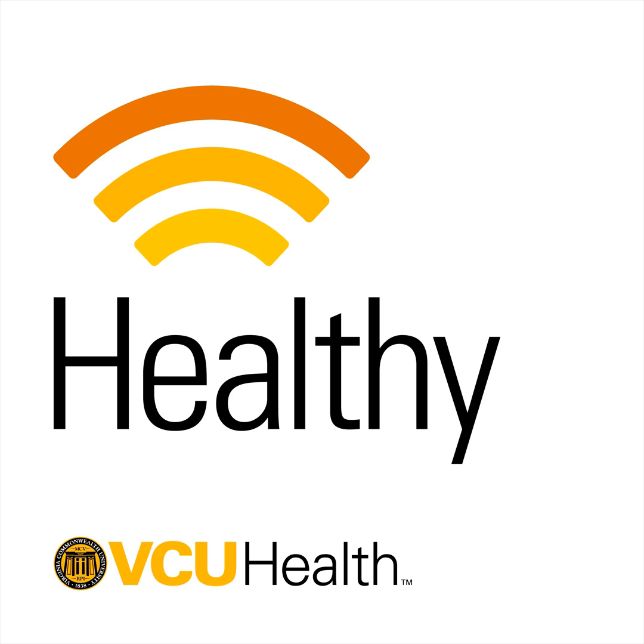And the primary advantage of this, well, there are several, but regarding the conversation we've been having, if you turn off the electricity, usually the side effects and the benefit also go away. So if you turn it on and you get tingling in your hand, you can turn it off and that tingling goes away. Or what's more likely to happen is we can change many different parameters of how that electricity is delivered, oftentimes to eliminate those side effects while keeping the benefit on the tremor. And you can imagine those settings can be changed over time. So as the disease progresses and gets worse, you can kind of keep up with it over time.